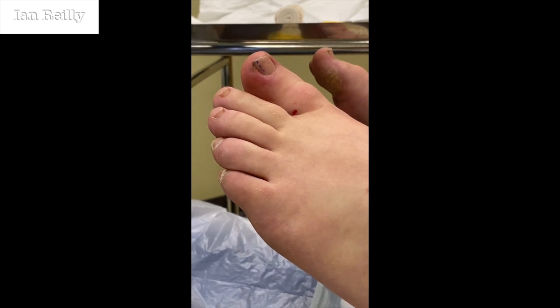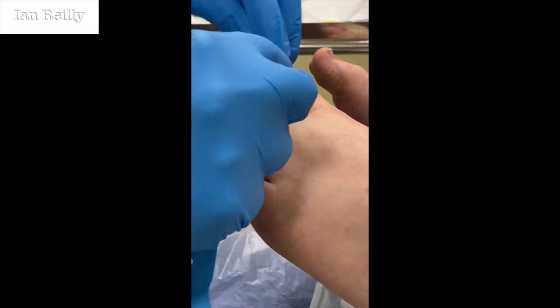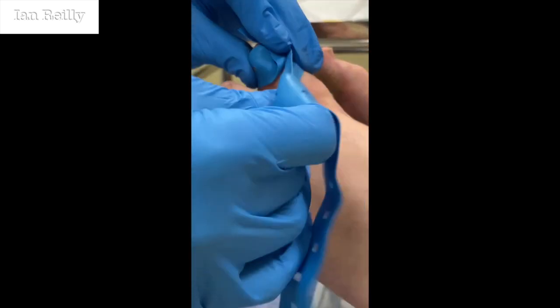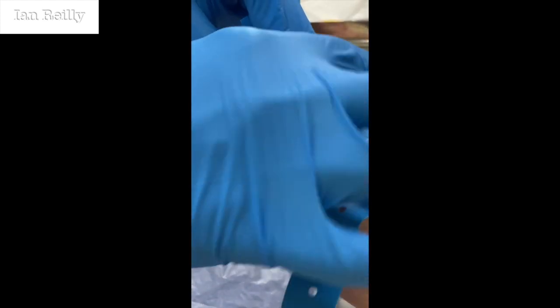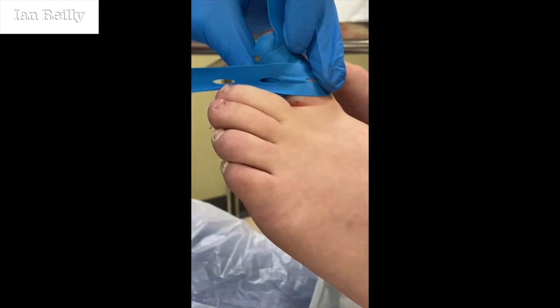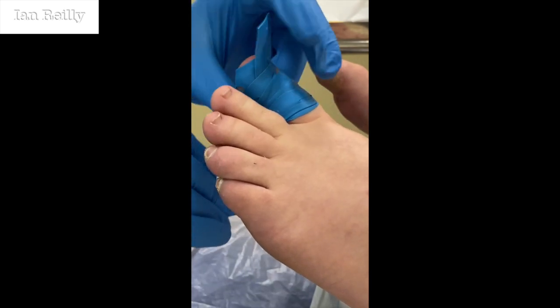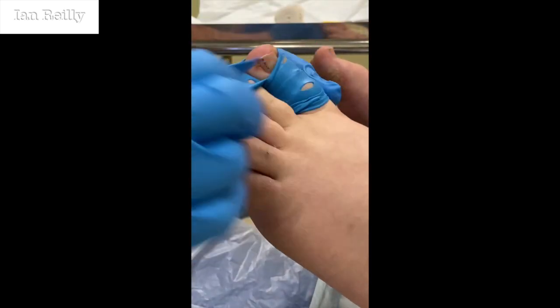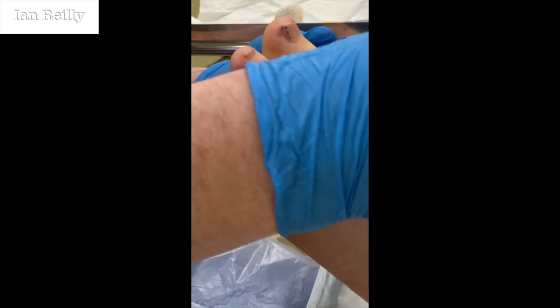Okay, so we do these under a little tourniquet, Sophie. So there's no bleeding until we take the bandage off, and then there's a little. Okay, so that's an elastic band. Well, we can go a little bit higher tech than this now. It's actually the most difficult part of the procedure, trying to get this on, particularly if your hands are wet.